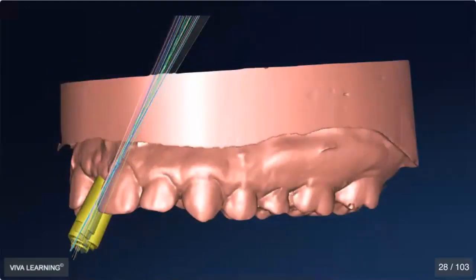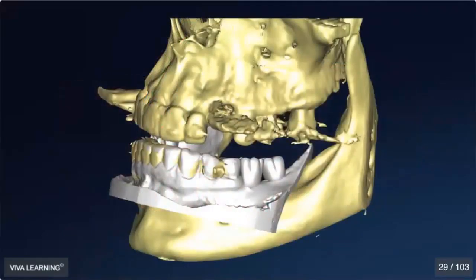And here it is, sorry, from a lateral view. Even in a simple case, look at the differences in potential angulation based on those separate strategies. So we're potentially incorporating a lot of possible error in terms of implant position, just based on how much information we're willing to collect together in order to plan these cases. So how about a 18, 19 case? Not even a bridge case, but a single unit posterior molar case.